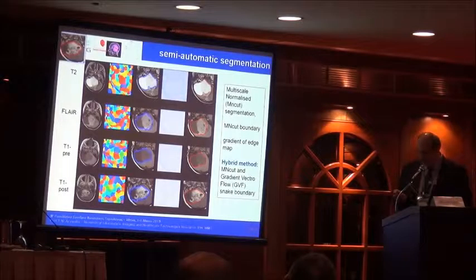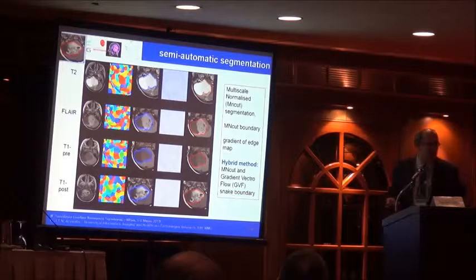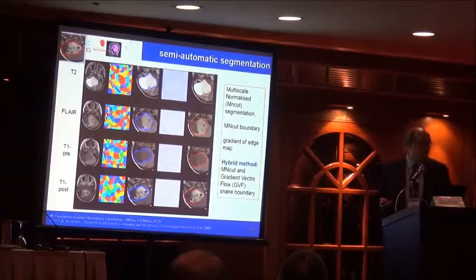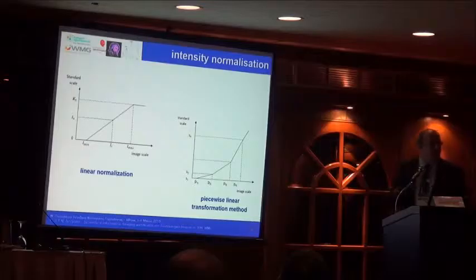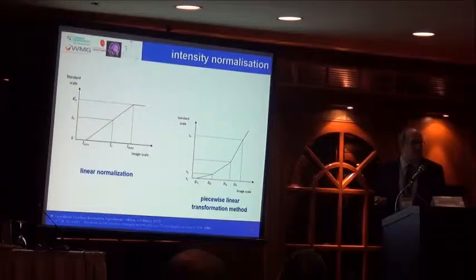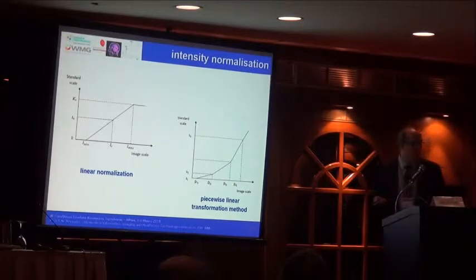And that is a big challenge if we want to put this into clinic, because radiologists have about 30 seconds, exaggerate, have very little time per radiograph, so per image, so they have to look at that. Of course, normalizing the data is very important, and we don't do anything more clever than we have been doing in the past. Either a linear normalization, which is the simplest approach but a little bit crude, or we try to look at local variations in big images in a way so that we do a piecewise linear normalization approach.